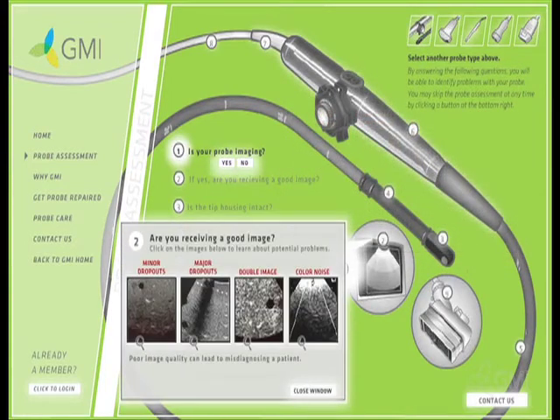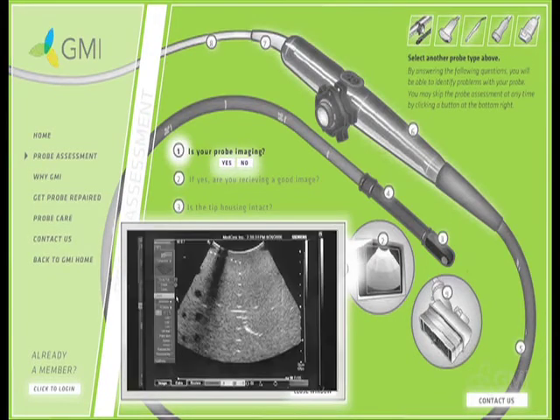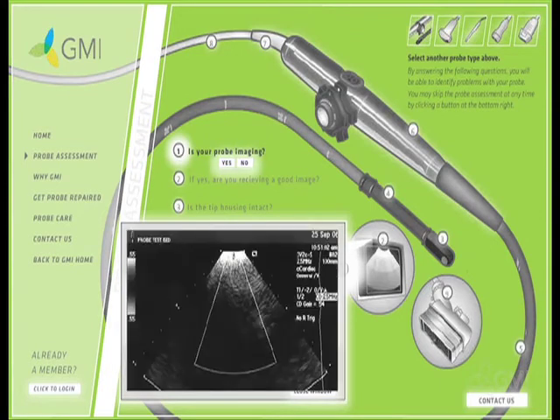Once the visual inspection is complete, proceed to imaging with the probe. Look for dead or weak elements. Check image clarity, depth and penetration. Also look for Doppler noise, either color or spectral Doppler.